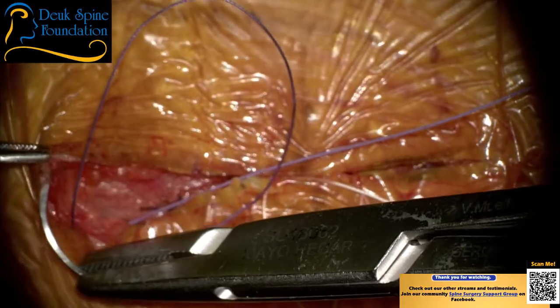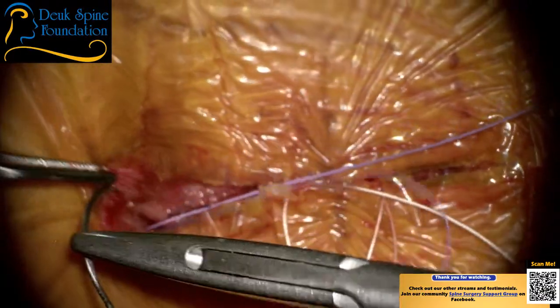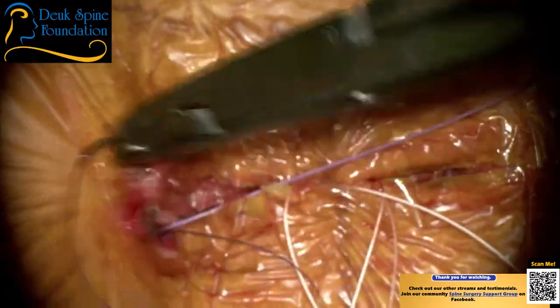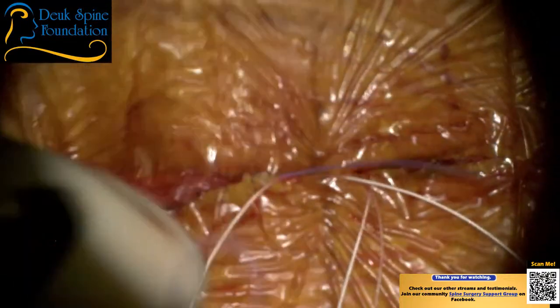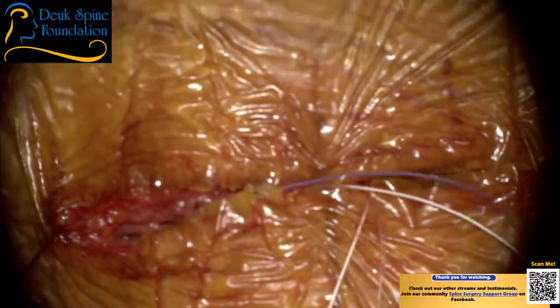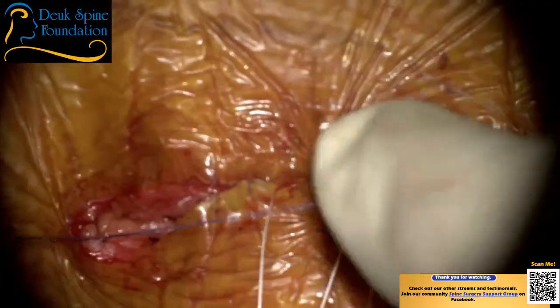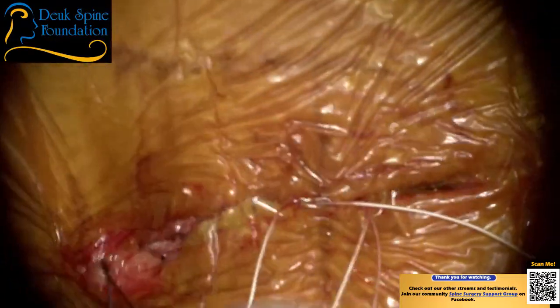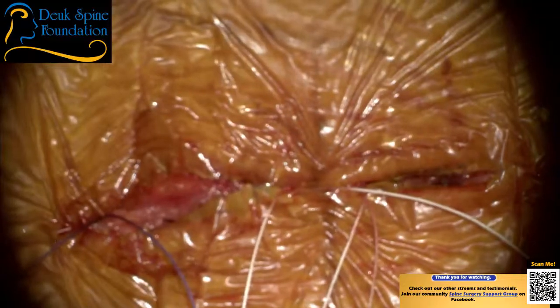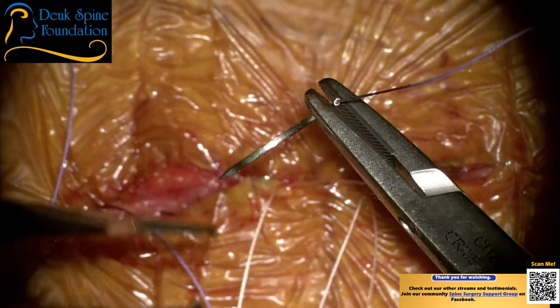Sutures are only needed for maybe a few months while the tissues heal. And once the tissues are healed, you don't need them. But you can't go back in and take them out, because going back in to take them out means you have to cut the patient again, which means you have to suture them again. You're going to need a lot more than that. Maybe another pack.